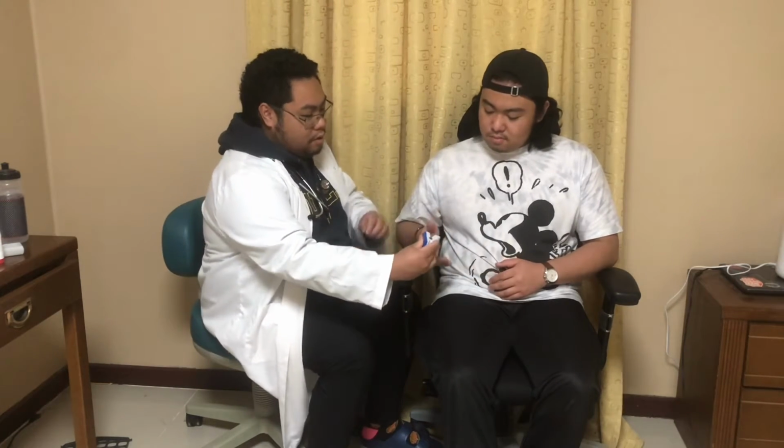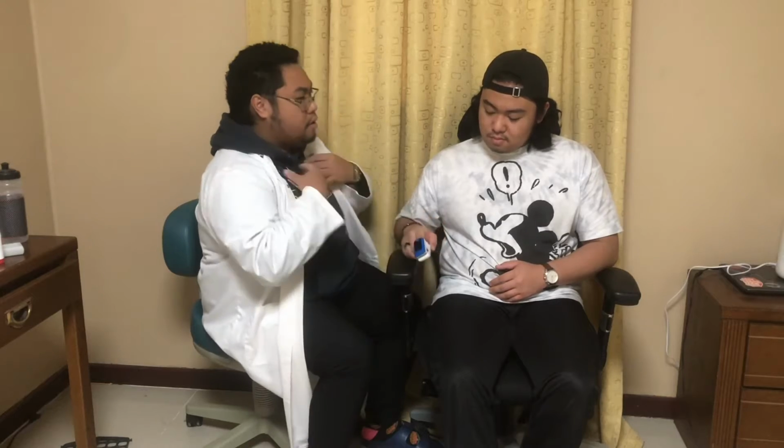So sir, I'm just going to be taking your vital signs, your respiratory rate, your heart rate, and also your oxygen saturation and your PFER. Are you comfortable with that? So sir, can you put this on your finger? Assessing the patient's vital signs will help us obtain baseline data and other findings for the patient. So now we're going to be measuring the patient's heart rate, respiratory rate, and the breathing pattern if there are any abnormalities. So sir, I'll start now. Are you okay with that?